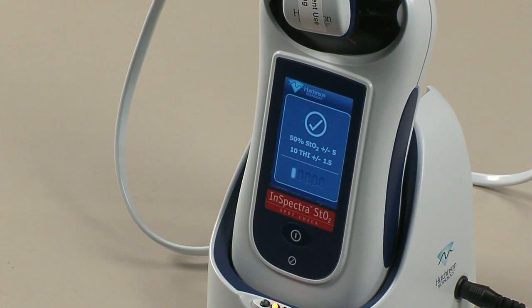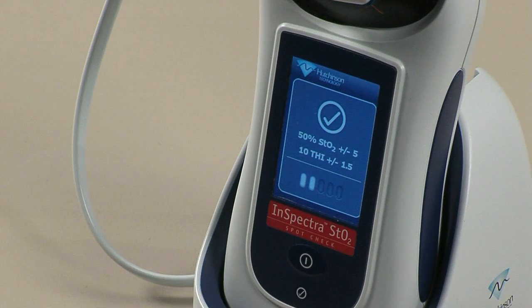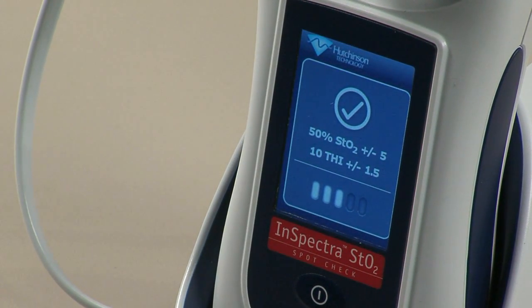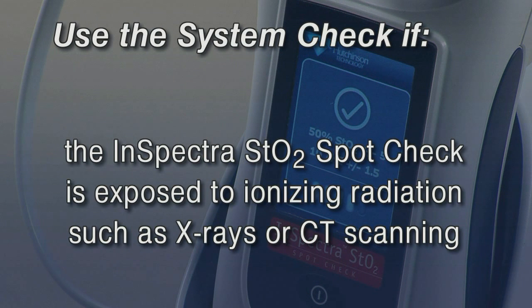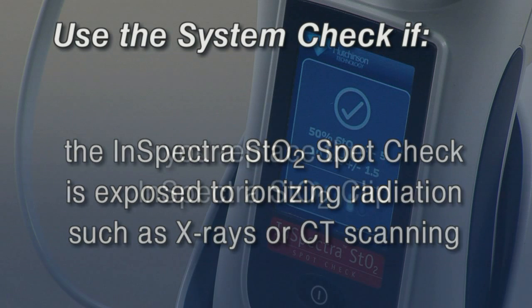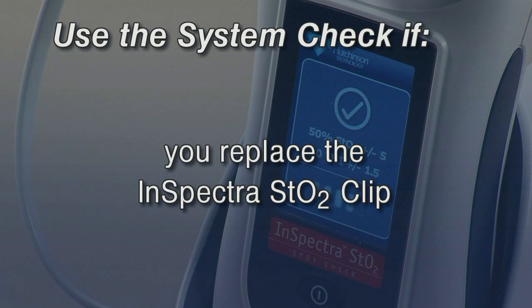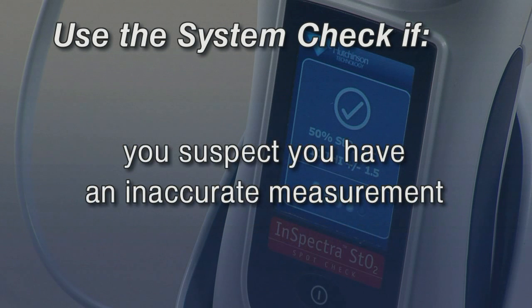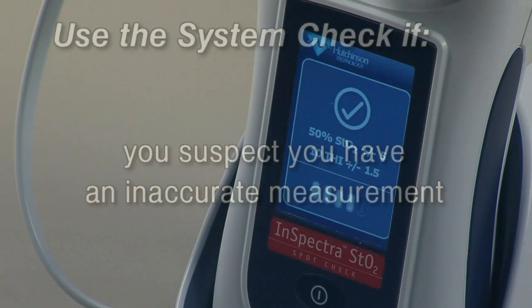The system check allows you to quickly verify the ability of the InSpectra STO2 SpotCheck system to accurately calculate STO2 and THI. Use the system check if the device is exposed to ionizing radiation such as X-rays and computed tomography scanning, when you replace the InSpectra STO2 clip, if you suspect damage to the device or any of its components, or if you suspect an inaccurate measurement.